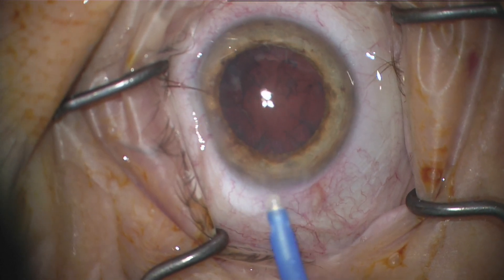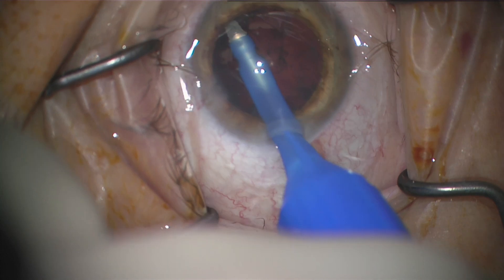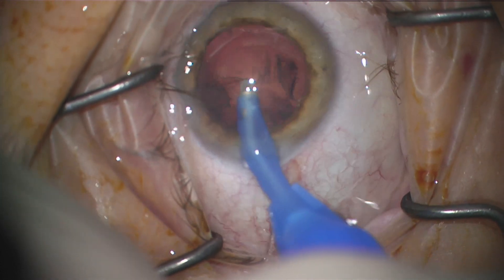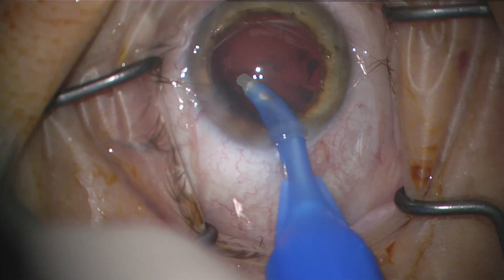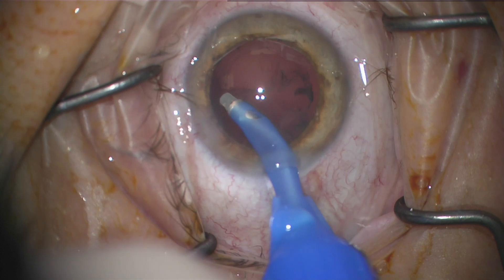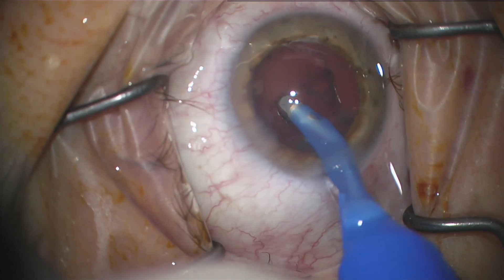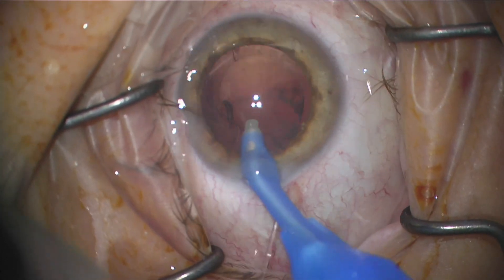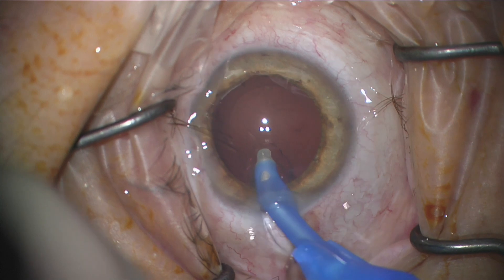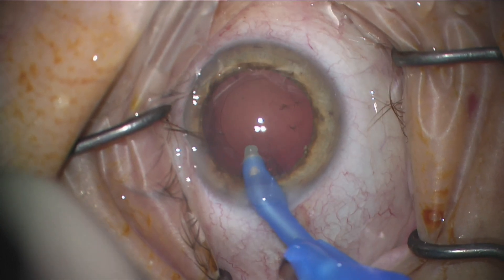Here is the irrigation aspiration tip — very similar to other ones you'd normally use. This wound by the way is 2.4; I normally use 2.2 and had to extend it to 2.4 for everything to fit. One gripe I have about this IA is that it's kind of thick, and so is the handpiece — it's pretty thick so it doesn't spin around in my hands easily. I'm still using the throttle, so there's still a clicking noise, and it's a little bulky when trying to grab the sub-incisional cortex.